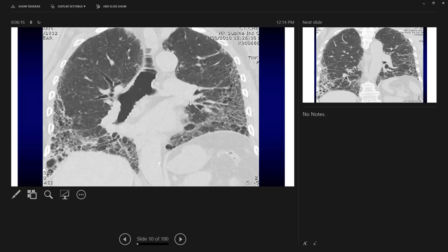There is honey combing and traction bronchiectasis, with pleural-based involvement that worsens as you go inferiorly. Honey combing shares the same pathogenesis as traction bronchiectasis: fibrosis causes traction of the airway, but it happens very distally, pulling on the terminal bronchioles and creating rounded structures at the pleural base. This indicates a chronic process involving the sub-pleural space.